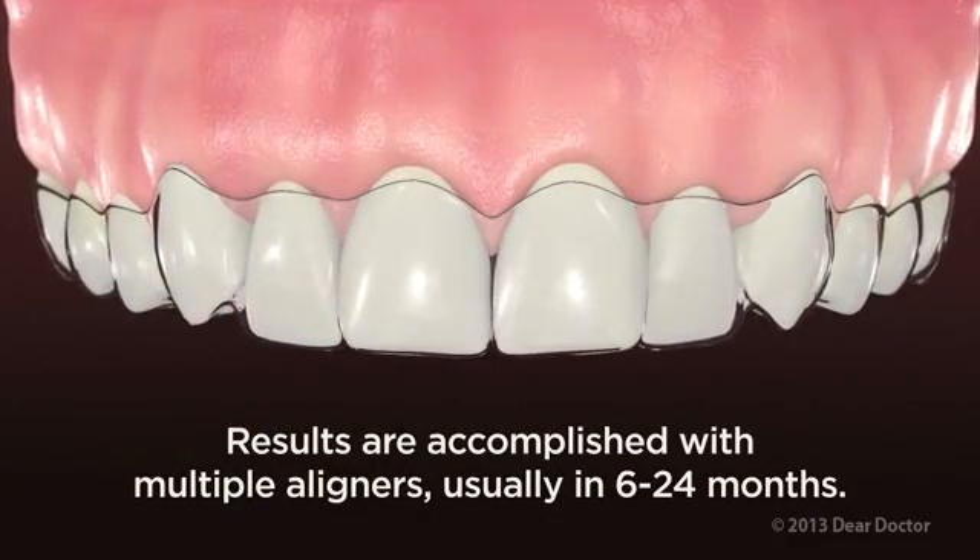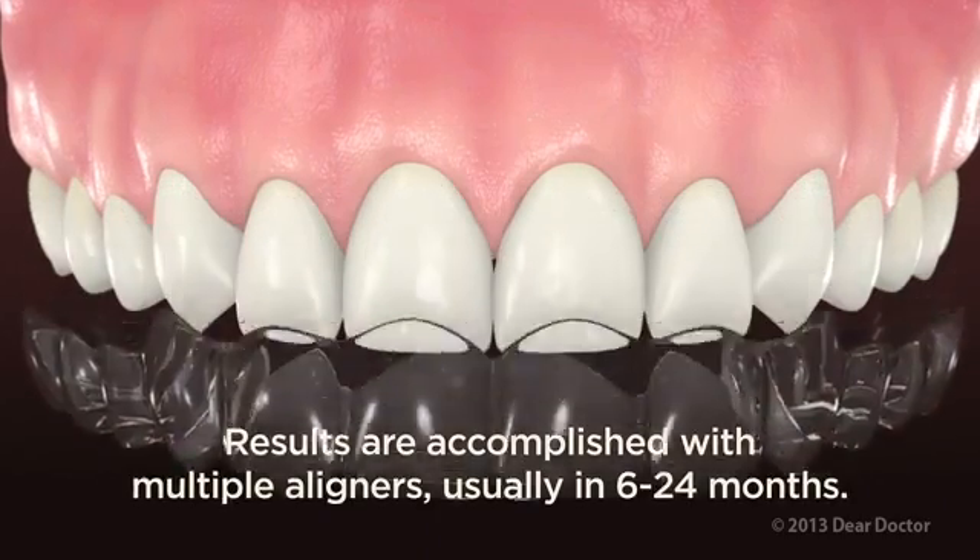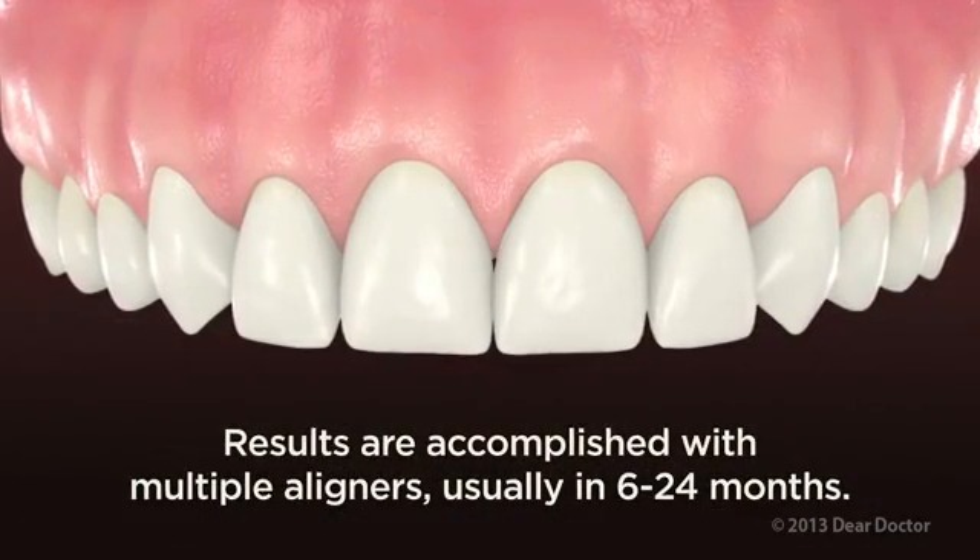So how can such a thin, removable tray get the job done? Believe it or not, the same way as traditional braces — by applying carefully controlled, gentle forces to the teeth.